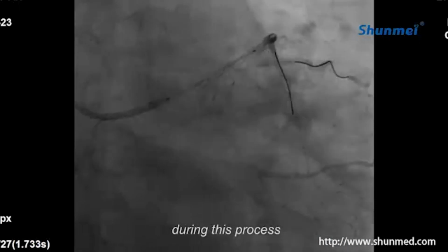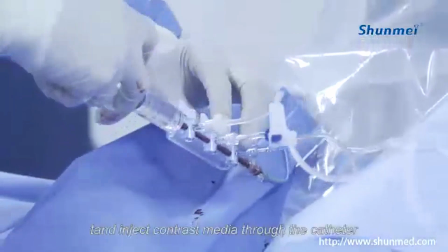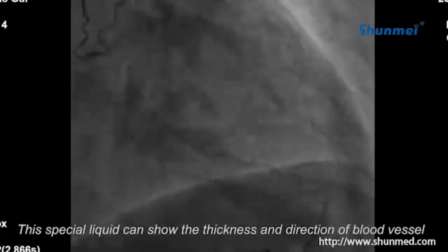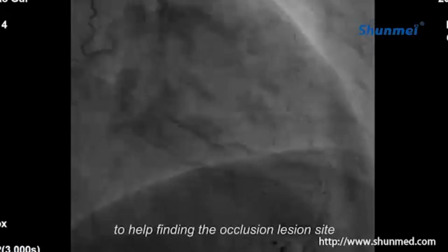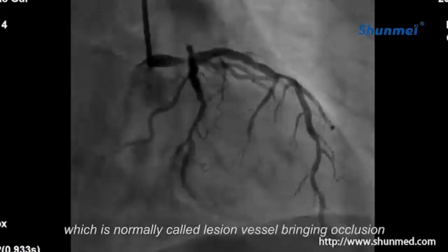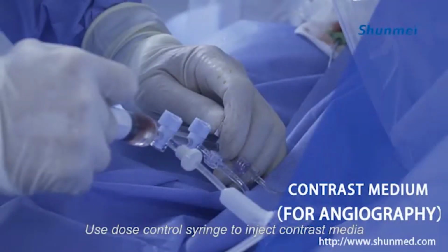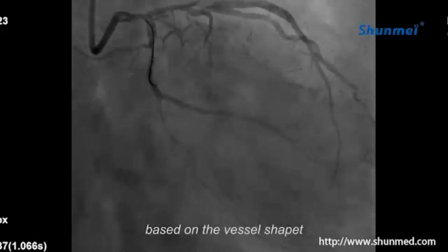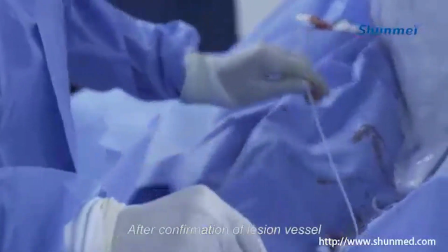During this process, the physician needs to use fluoroscopy to capture the condition and inject contrast media through the catheter. This special liquid can show the thickness and direction of the blood vessel under X-ray to help find the occlusion lesion site, which is normally called the lesion vessel, causing occlusion. Use a dose control syringe to inject contrast media to confirm whether there's a lesion or not, based on the vessel shape displayed on the computer screen under fluoroscopy. After confirmation of the lesion vessel, withdraw the angiographic catheter.